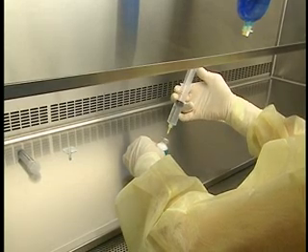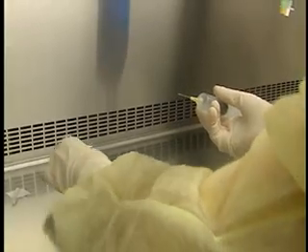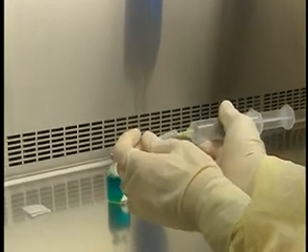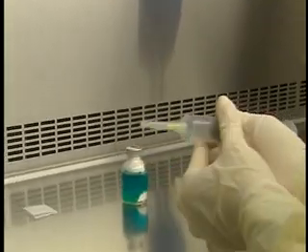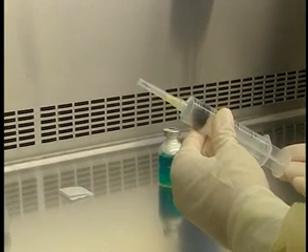Place the vial on the work surface and remove the needle. To prevent a needle stick, recap the needle slowly, your wrists pressed against each other. Take care not to contaminate the needle. Set the syringe aside.